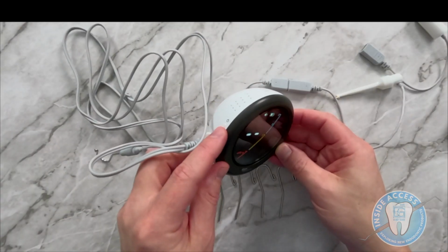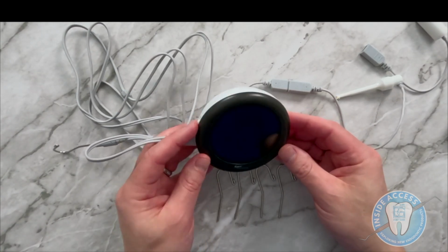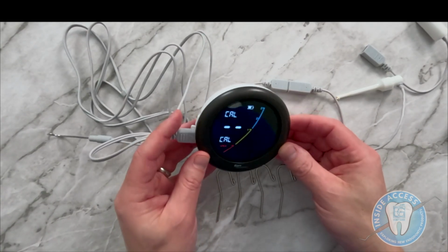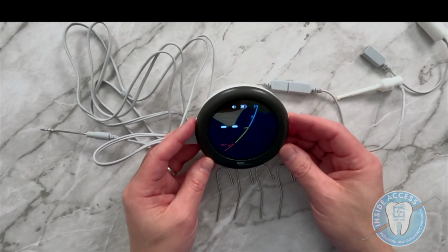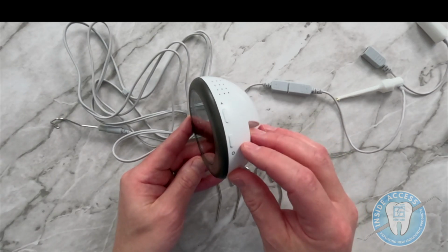Okay, so the unit is powered on here with this button on the left, and that powers it on and off. Now, it does have an automatic shut-off as well, so the calibration is set automatically, but we can use these buttons on the right side for different settings.